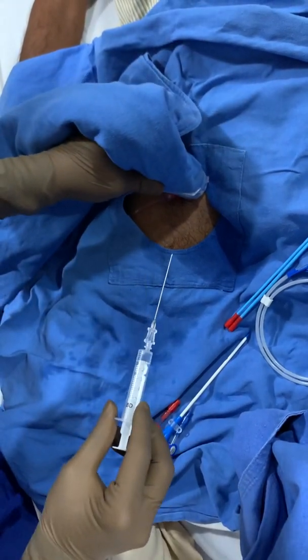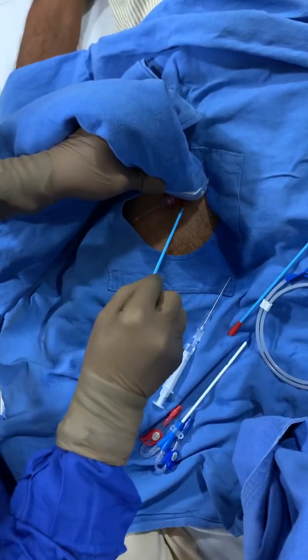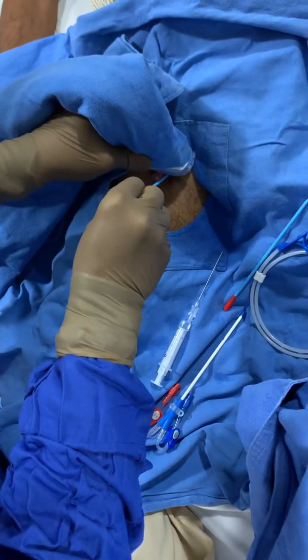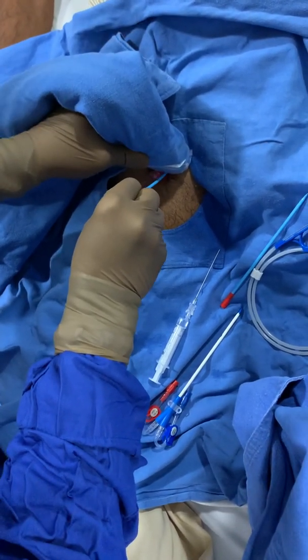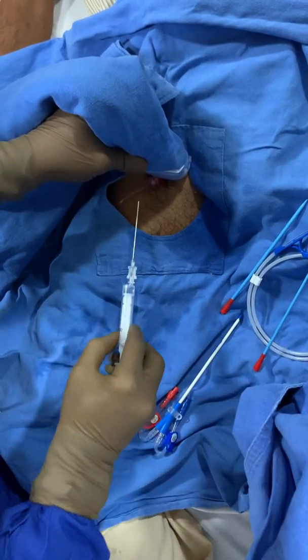I'll be waiting for the local anesthetic to come into action. In between, I'll just see the site of puncture — this has to be my site of puncture. So then I'm now going down.